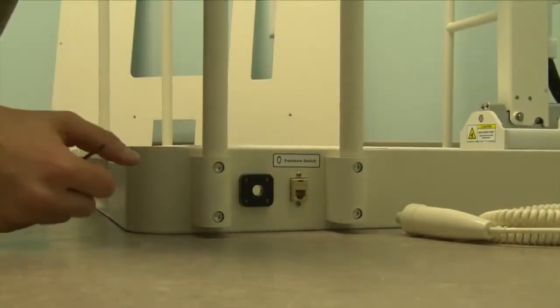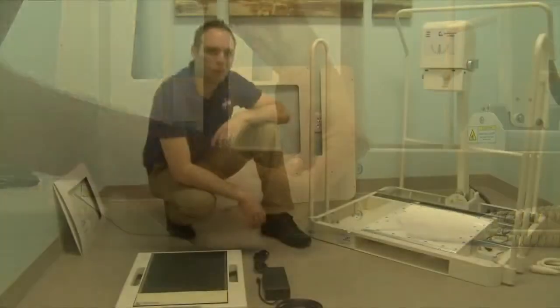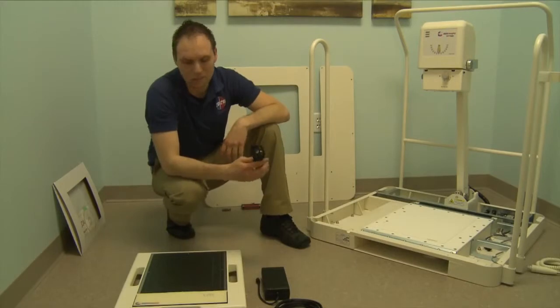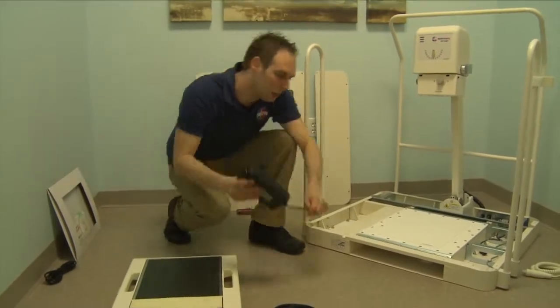We're going to now remove the grommet from the right side of the base using the provided Phillips screwdriver. Once you have the DR panel unpacked, you'll find the power cable. You can go ahead and set that aside as it's not necessary — it's integrated into the base. We'll start with putting the power supply inside the base.